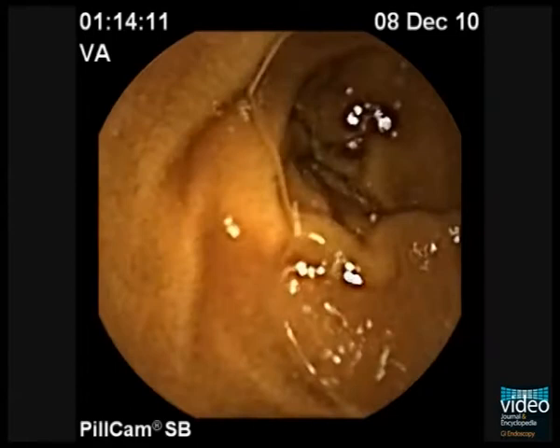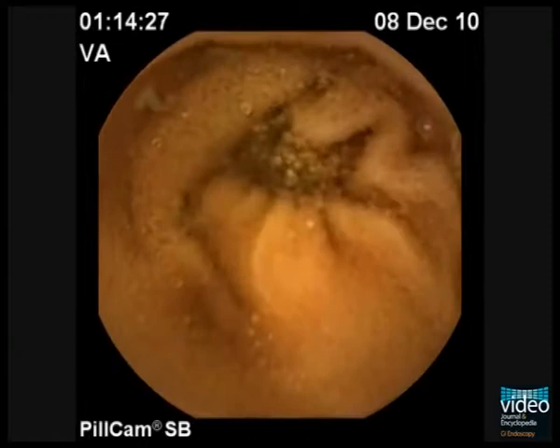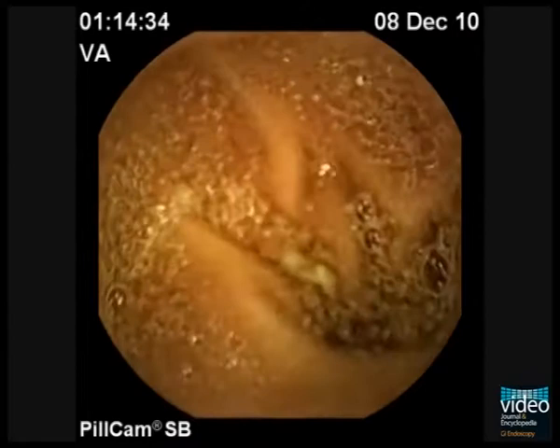In this video, you can see the second capsule endoscopy performed on this patient with ongoing obscure overt gastrointestinal bleeding. A first capsule endoscopy, two days earlier, only showed fresh blood at the end of the first quartile of the entire length of the small bowel recording, but a subsequent push enteroscopy failed to identify any lesion.